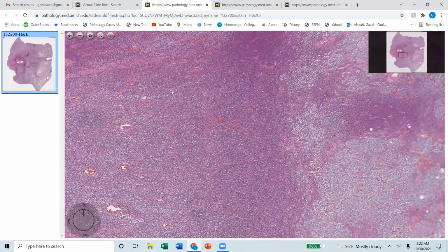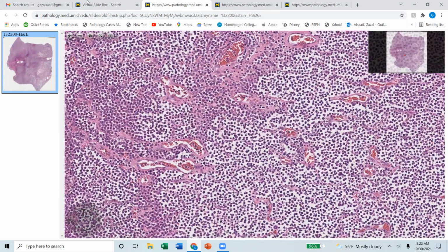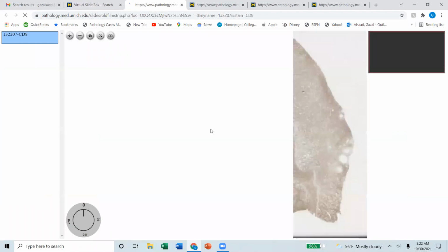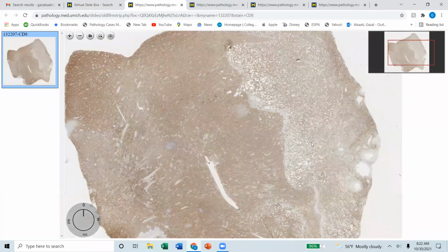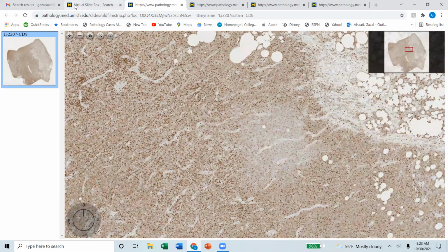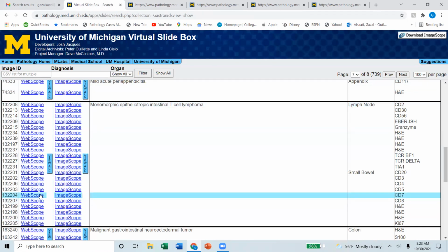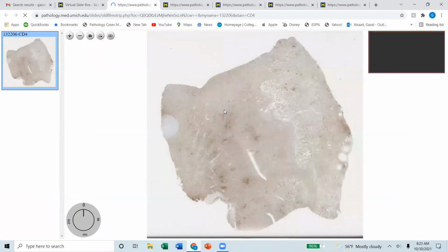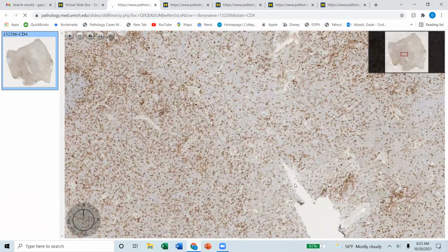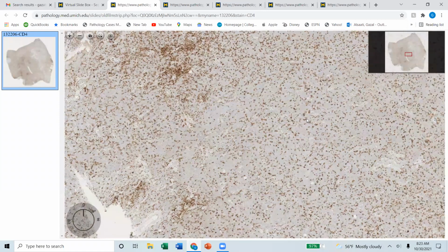And these cells are CD8 positive. They are CD56 positive. CD3 of course, but these are T cells, so CD3 and CD2, but they have given a CD8 stain over there as well. This is our CD8. So you see nice CD8 positivity in them. They are CD4 negative. Oh, that's the trick. Yeah, CD8 positive. So this is a CD4. Let's look at it. You see that the majority of the cells are negative. And that's it.